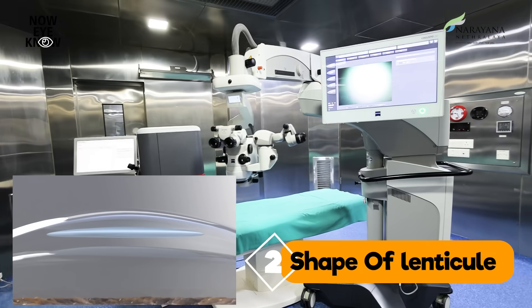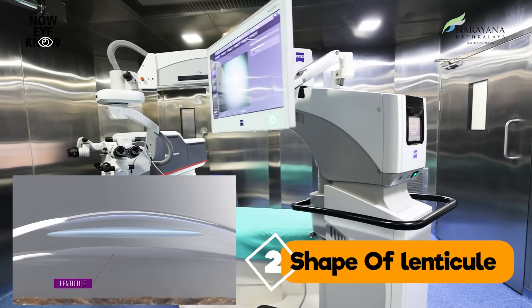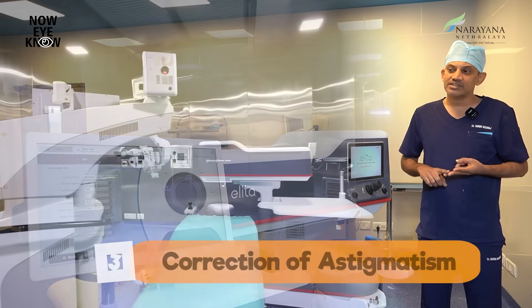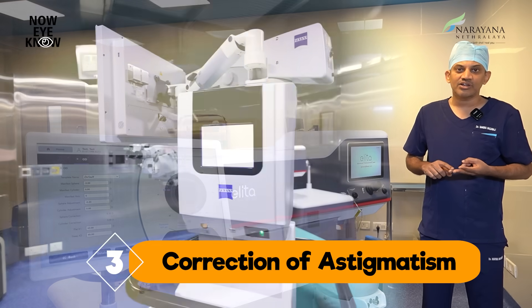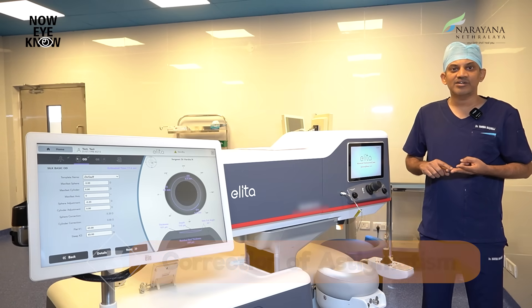The second distinguishing feature is the shape of the lenticule. It provides a biconvex lenticule, which is different from other lenticules. This biconvex lenticule ensures that the convexity of the cornea is maintained, therefore providing clear vision. The third feature is that the inbuilt software also provides an option to correct for any eye rotation, or torsional movement as we call it, which is very important to correct the astigmatism part of the refraction.